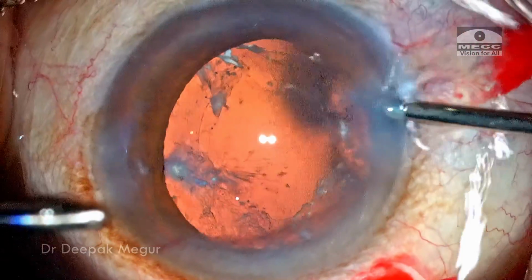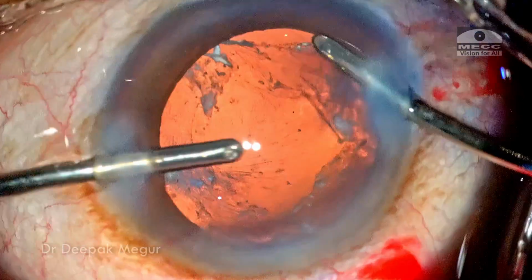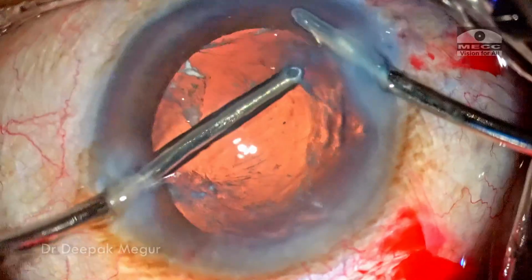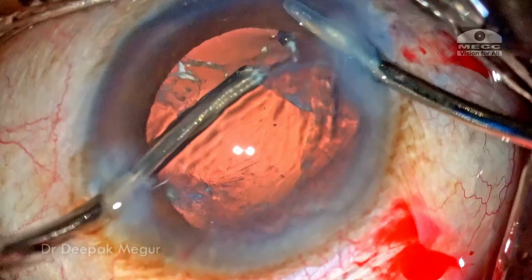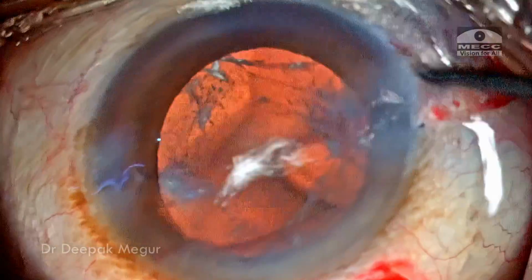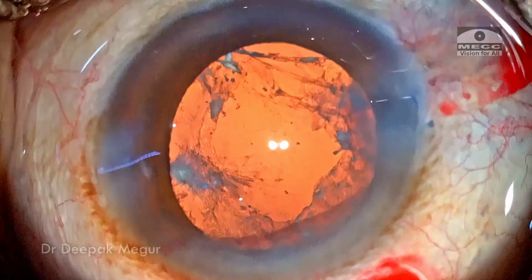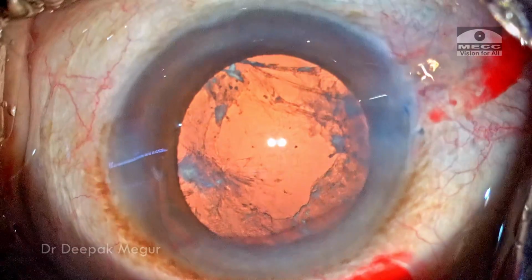The second option always is to just sacrifice the entire bag, pull it out and then place an iris clip lens. But somehow I feel that the amount of inflammation and the overall outcome is still going to be significantly better if we have a posterior chamber lens. Of course, the mandatory thing is it has to be decently centered. So I'm still going in with my conviction to place the posterior chamber lens itself. Let's see how things turn out.